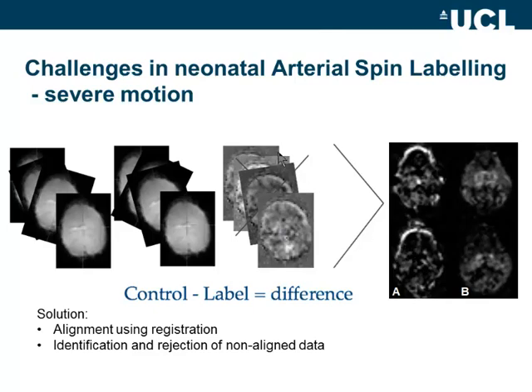While if you really take care to have an automatic alignment procedure, even in post-processing, as well as outlier detection and rejection, then once you've tried to align them and individual scans are still showing lots of motion artifacts, you need to take them out of the whole average automatically to avoid contaminating it. If you do this, you pay a little bit of penalty in terms of signal to noise, but it's not nearly as bad as it sounds. So you can recover very clinically relevant ASL.